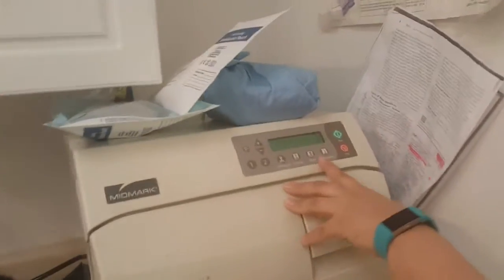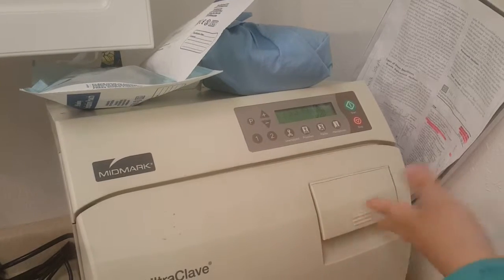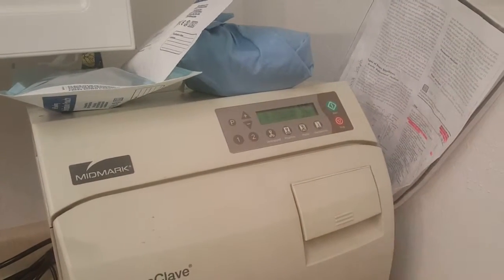Our autoclave has settings for pouches, packs, and unwrapped for flash autoclaving. I'm doing pouches, so I'm just going to go ahead and hit the pouch setting and hit start.